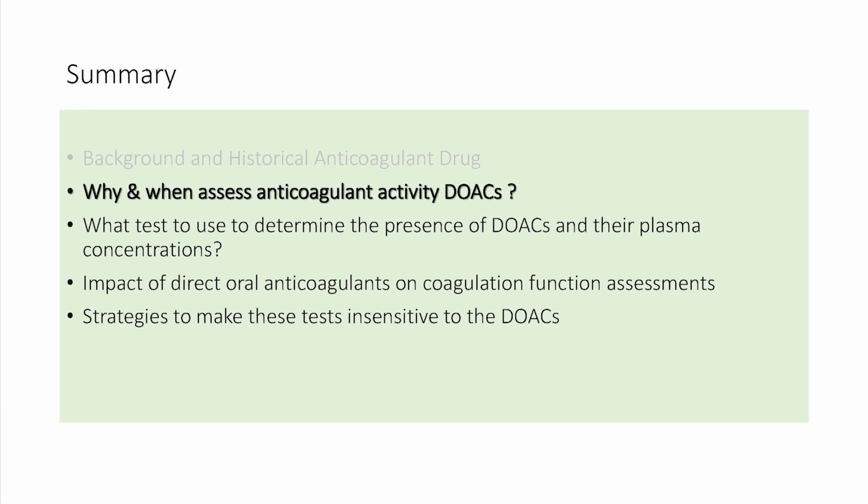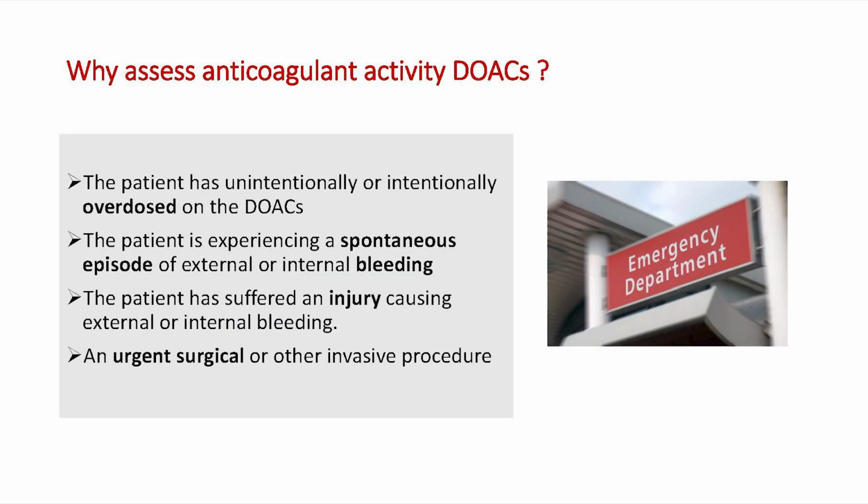Do we need to assess these drugs in certain situations? These drugs have a clinical complication like bleeding.